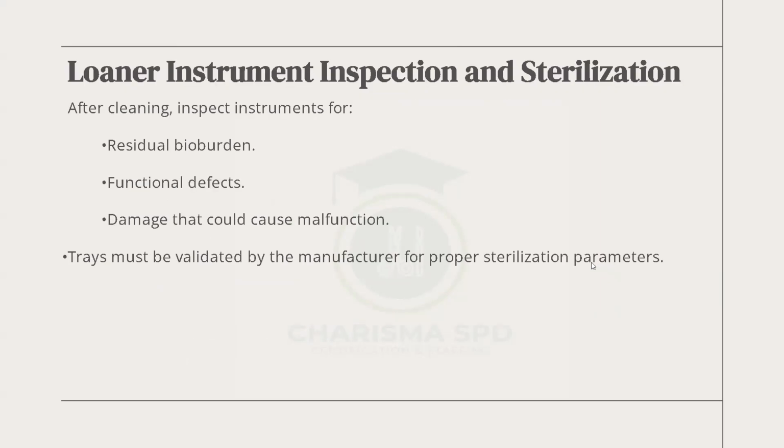So, bed functionality. Sometimes you don't know how it works, so you cannot check the functional part unless an in-service is done. But if you are lucky to know how it works, good. Use that expertise to further check.